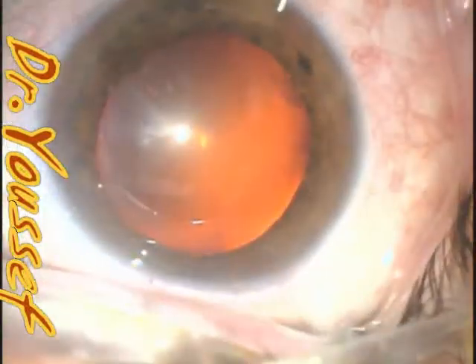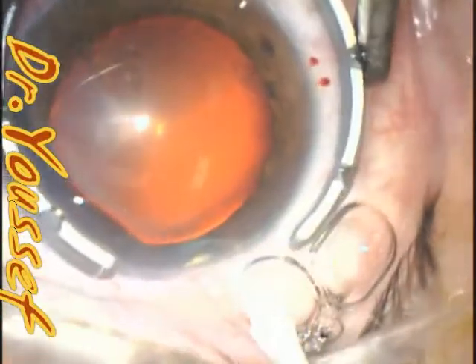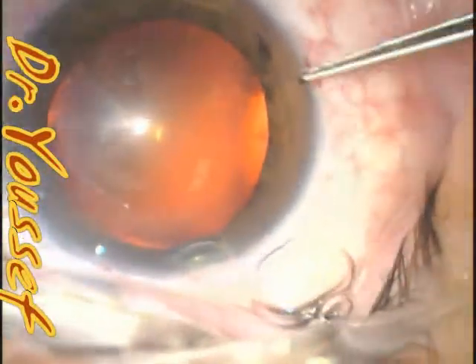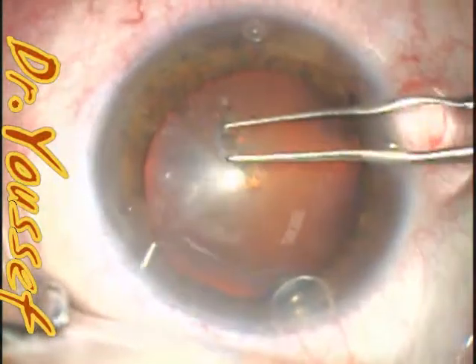Hi, I'm Dr. Youssef. I'm presenting this case of a haptic into the sulcus with a one-piece ZCB00 lens, and it should be discovered in the surgery.